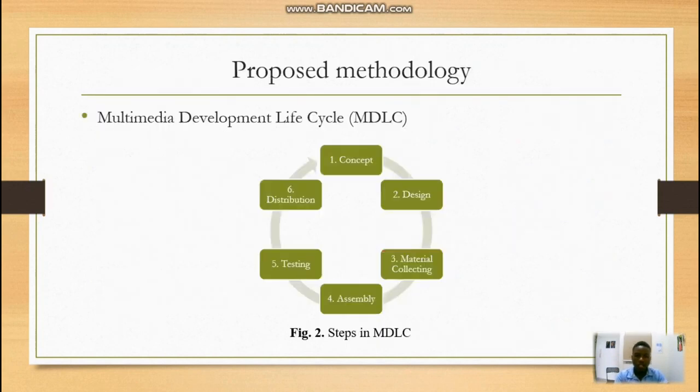Moving on further to that, we have the proposed methodology, and the system uses the multimedia development lifecycle, which moves in 6 steps. Firstly is the concept of what we want to do. We have to first define what the system is to do, and in this case, it is to replace the traditional methods and provide a more convenient way for our patients to have hand therapy at the comfort of their home without having to travel.